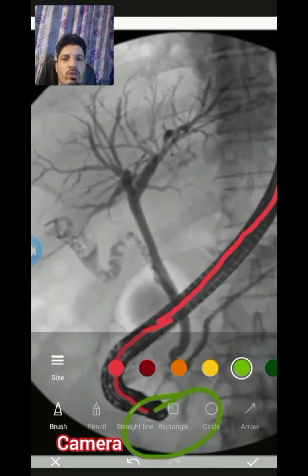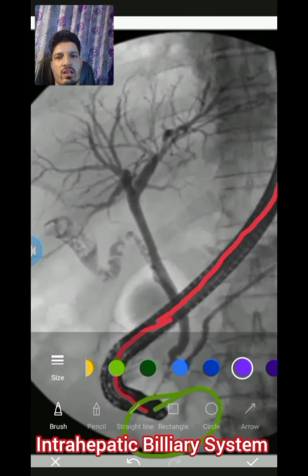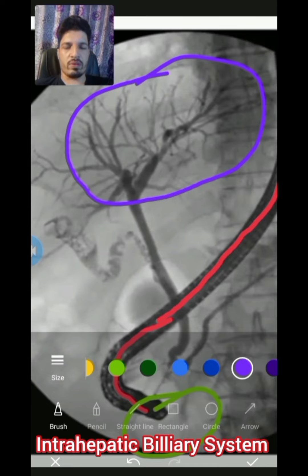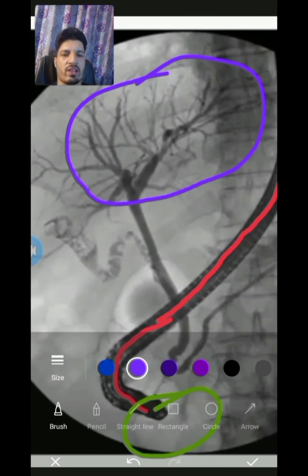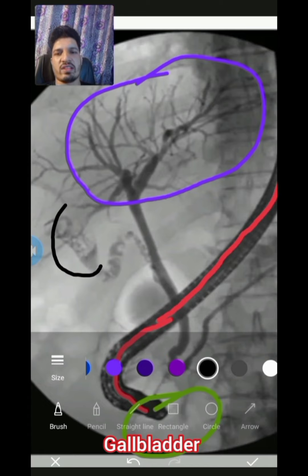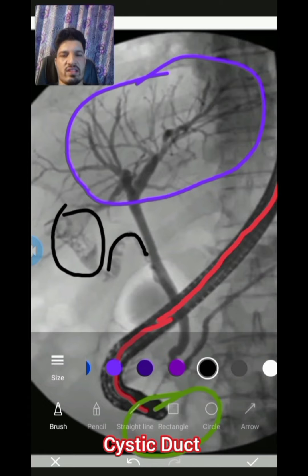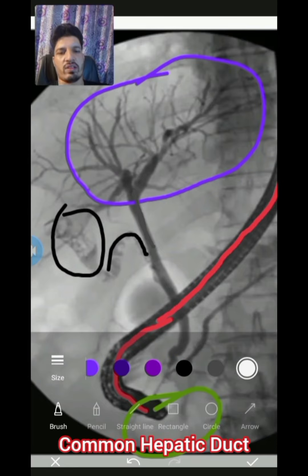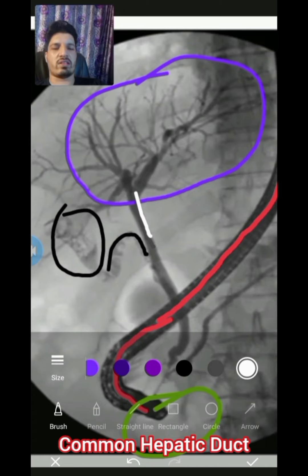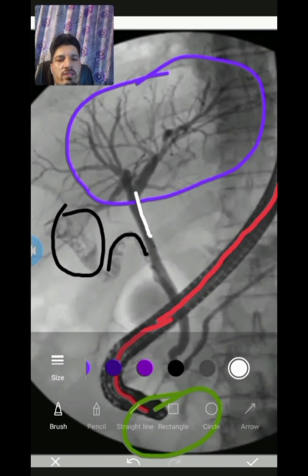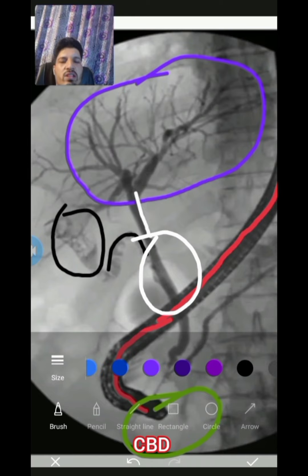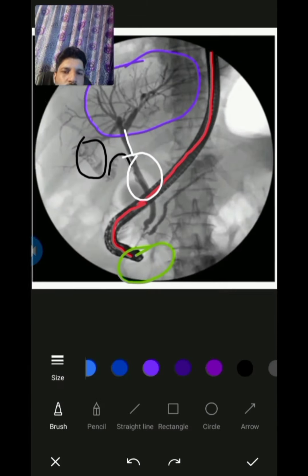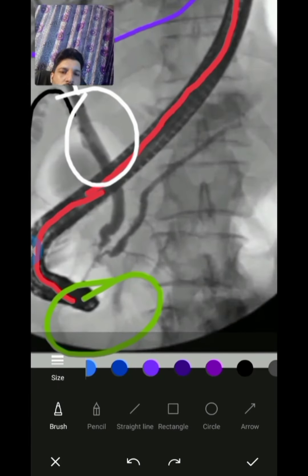Now I am marking this whole area — this is basically the intrahepatic biliary system. After that, in black you are seeing this is the gallbladder, and this one is the cystic duct. Now I am marking with white — this is the common hepatic duct. The cystic duct and common hepatic duct both combine and they form the CBD.